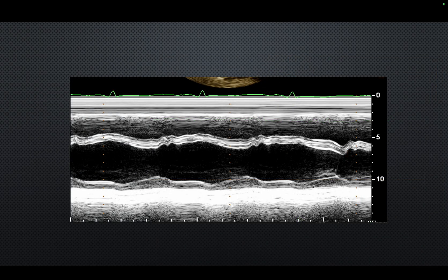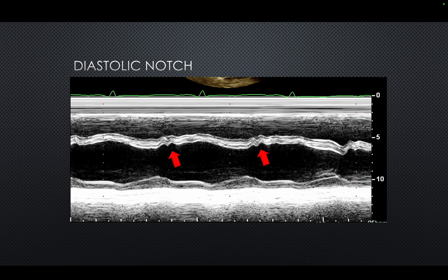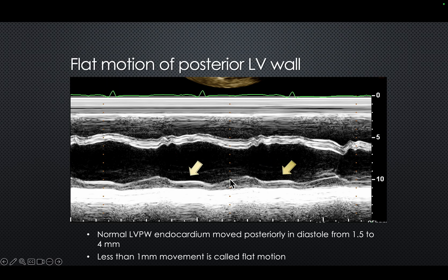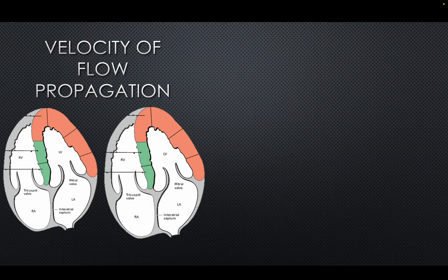The shudder is further elaborated on M-mode — you can see an early diastolic shudder at the level of the LBBB. When you see the QRS complex, you see the shudder here in LBBB pattern, and in CCP you see the shudder as well. You also have a flat posterior wall motion, which is again a characteristic of constrictive pericarditis.